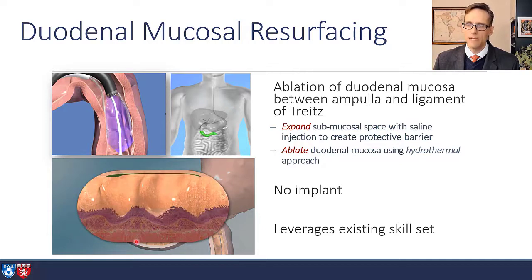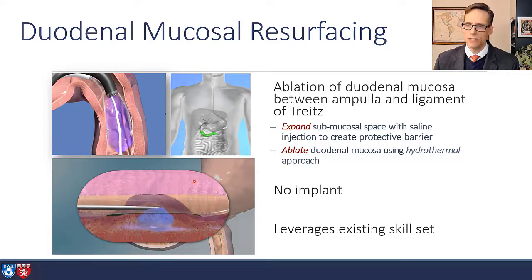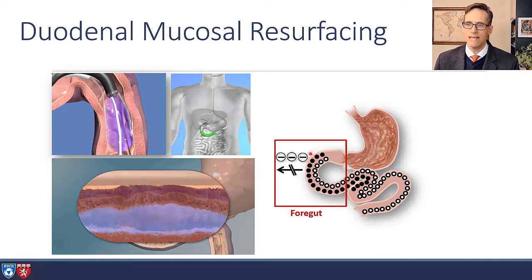And here you see the little channel the tissue is aspirated into, the needles advanced, and you get your cushion and then ablate that mucosa. So this really does not have any hindgut effects, but it does attempt to ablate this mucosa, kind of simulating a foregut effect or down-regulating anti-incretins. But that's a simplification. It's more complicated than that. I think it's resetting some stem cell activity.